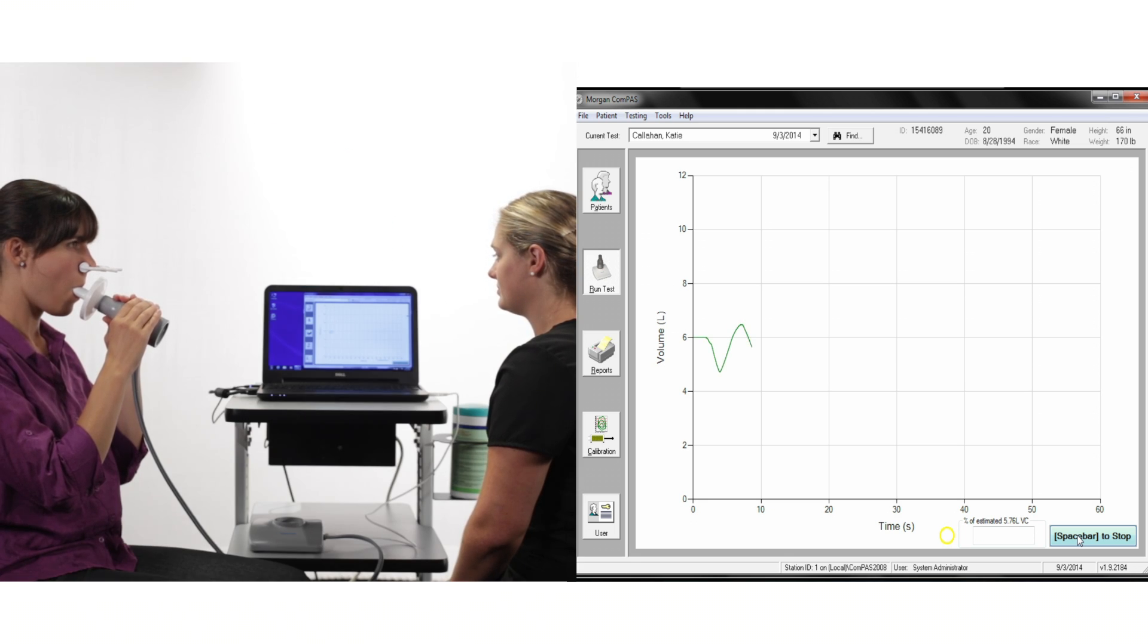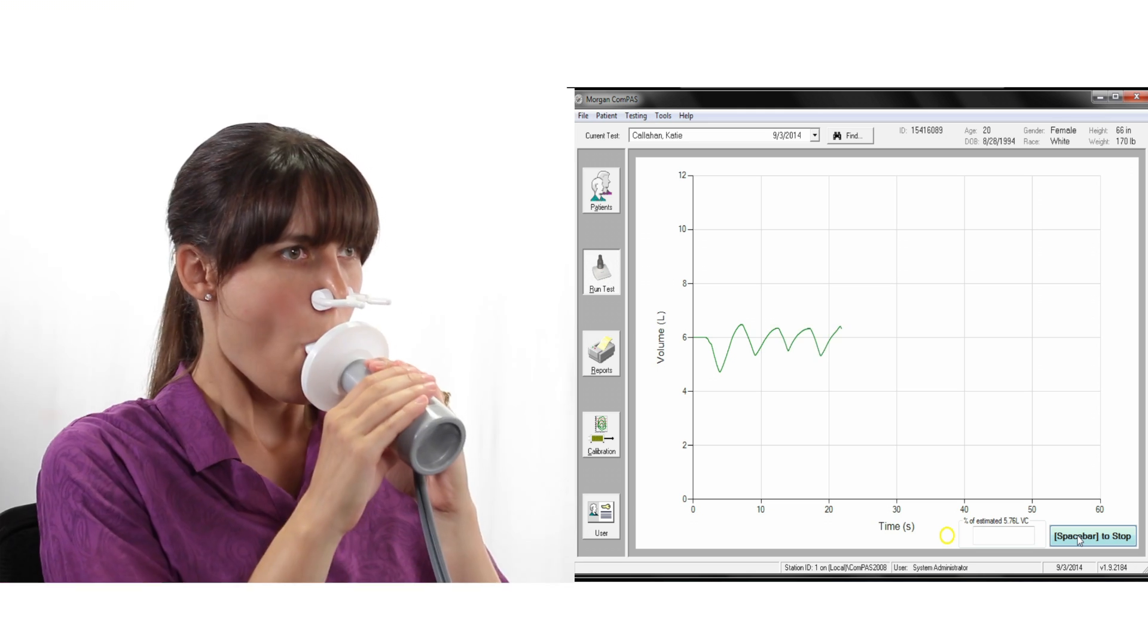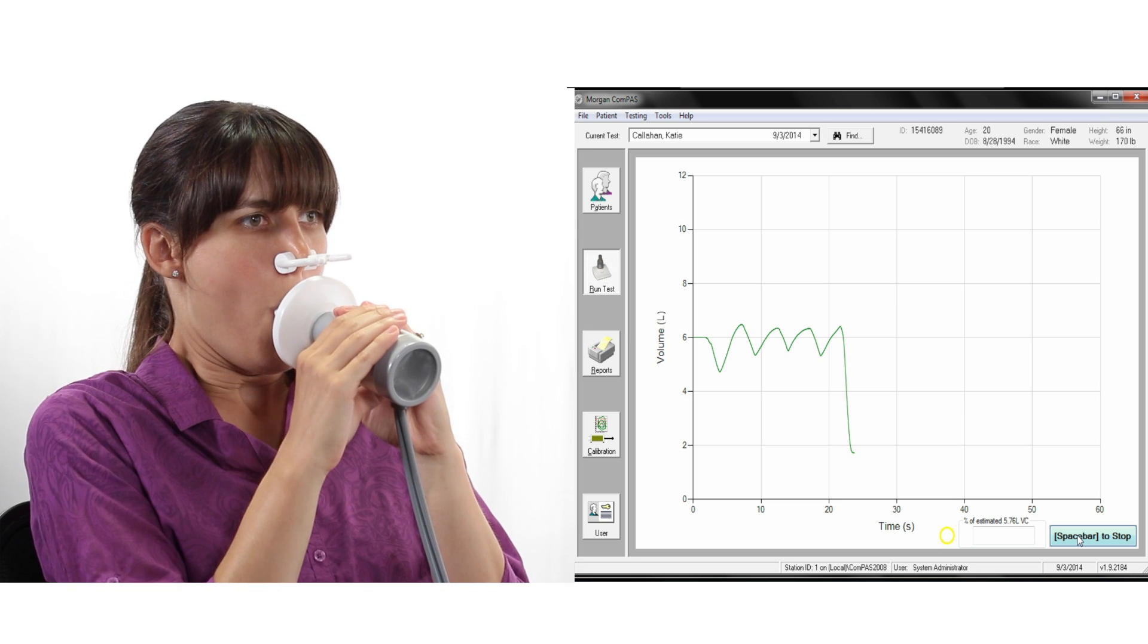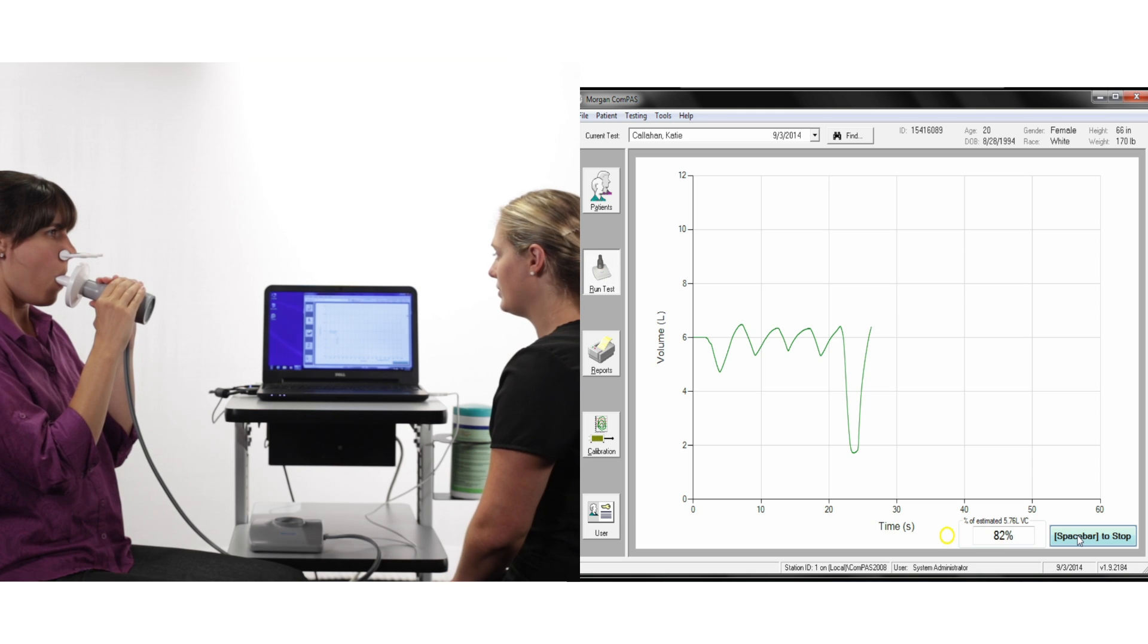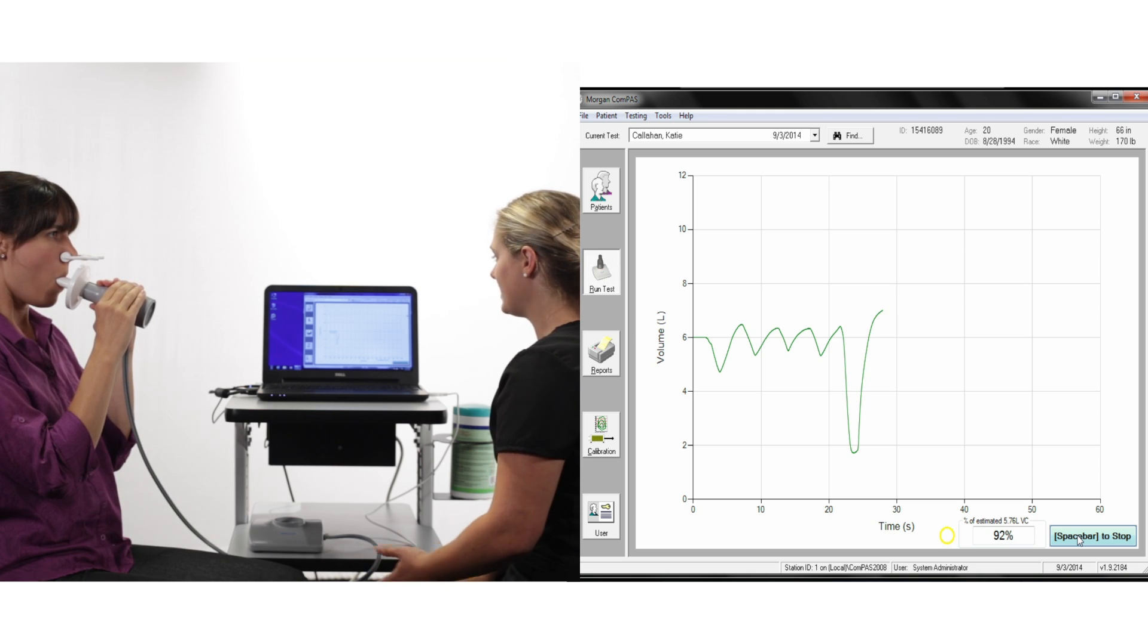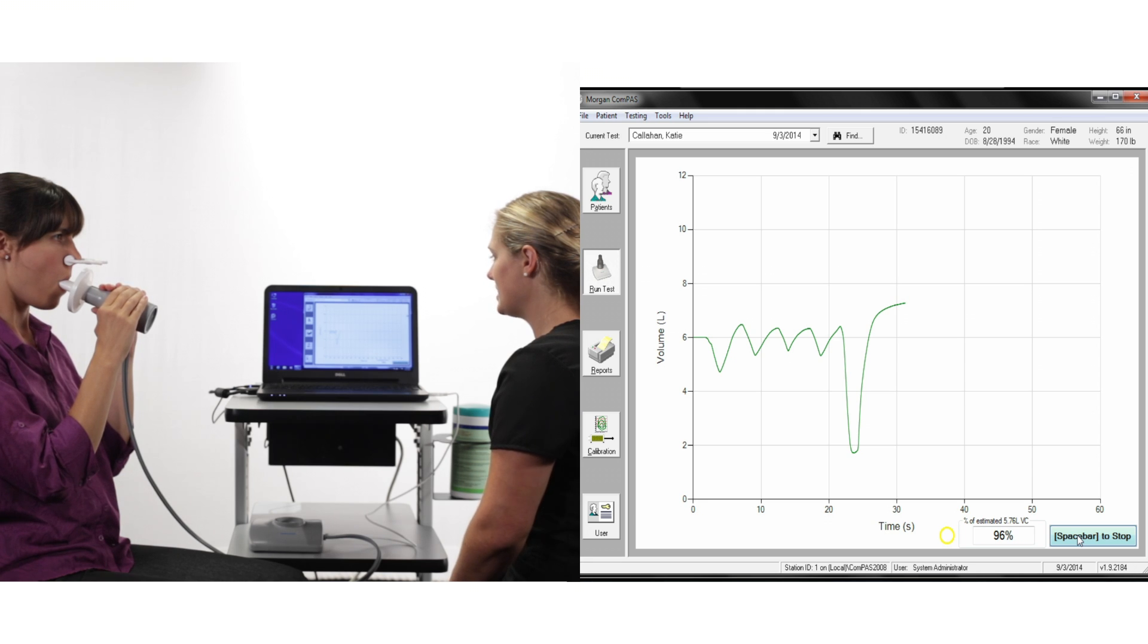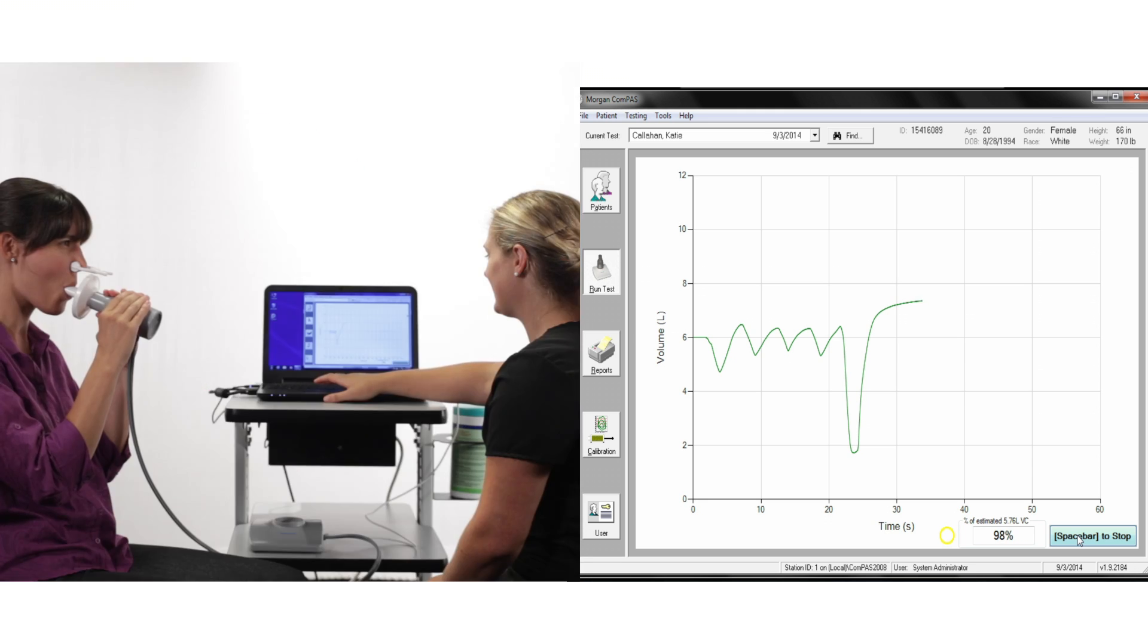Once three or more stable tidal breaths have been completed, ask the patient to take a deep breath in as far as you can. Then make sure they're fully inflated, then encourage them to breathe steadily out, slowly empty all the air out of your lungs and squeeze every drop out until you are completely empty.